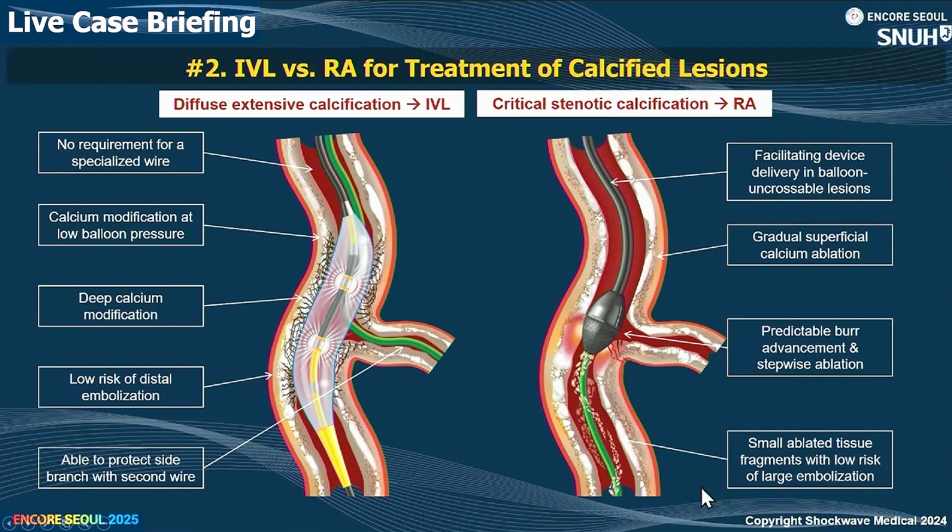First, facilitating device delivery in balloon-inaccessible lesions. Second, gradual superficial calcium ablation. Third, predictable advancement and stepwise ablation. Fourth, small ablated tissue fragments with low risk of large embolization.